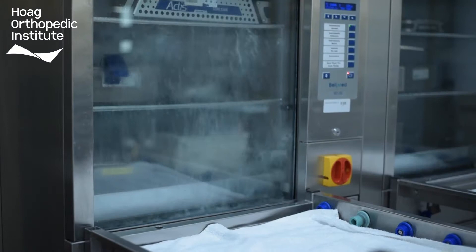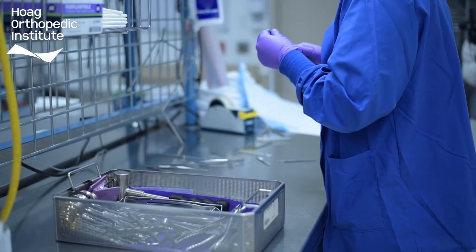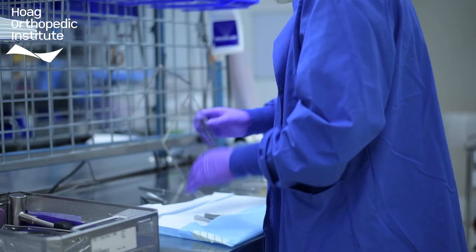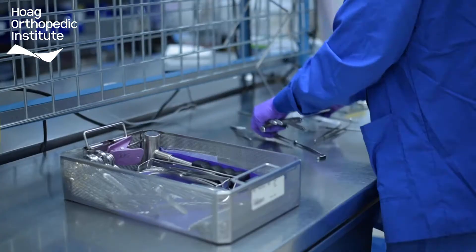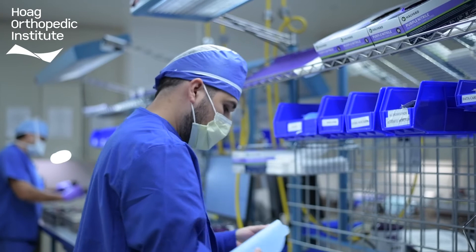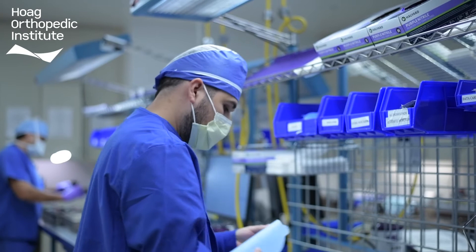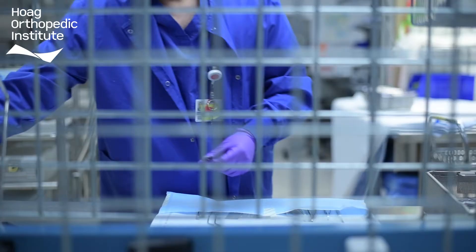From here the instruments are inspected and assembled in preparation for sterilization. During the assembly process, instruments are inspected to be sure that they are functioning correctly and then assembled into their appropriate sets made for different surgical procedures. Each set has commonly used instruments and instruments that are unique to the surgical procedure. In order to guarantee proper assembly, each sterile processing tech is responsible for learning each instrument and how it works. This provides a surgical team with everything they need to provide safe, quality care to our patients.